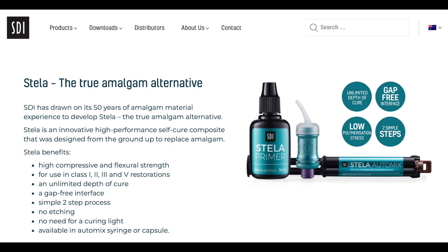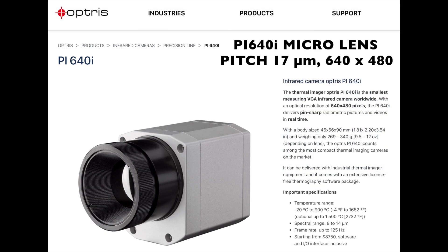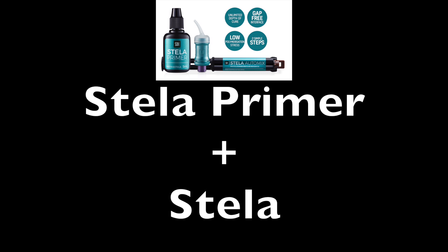SDI has introduced a new chemically cured composite that they claim is a true amalgam alternative. They claim that the Stellar Primer will accelerate the set of the Stellar composite. In this video, we're going to use a thermal camera to monitor the temperature change that occurs when Stellar is placed on top of Stellar Primer in a human tooth.